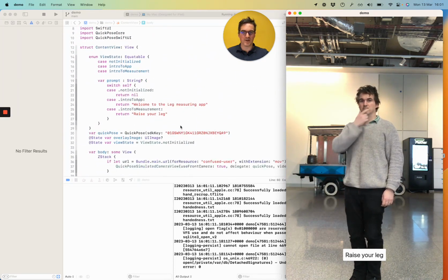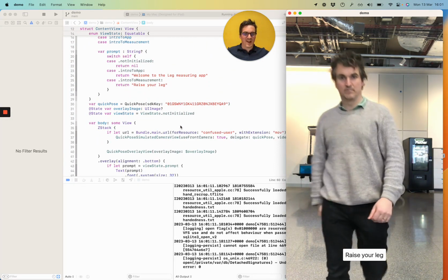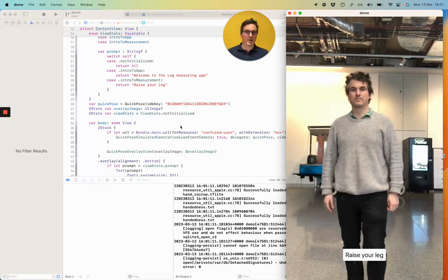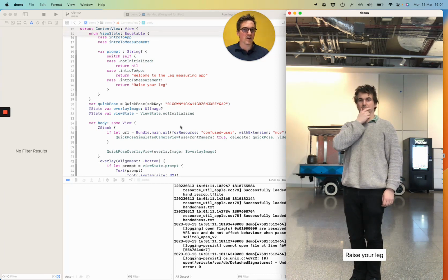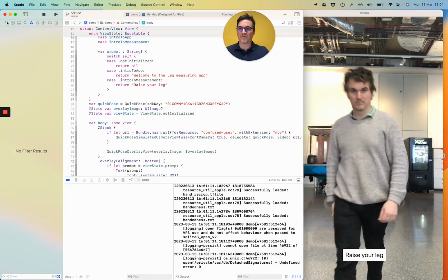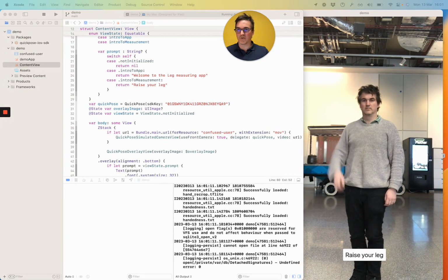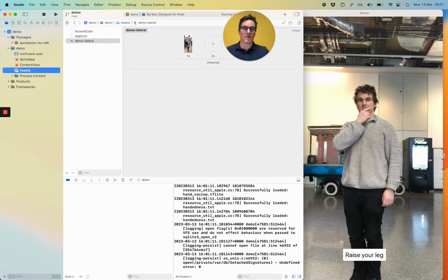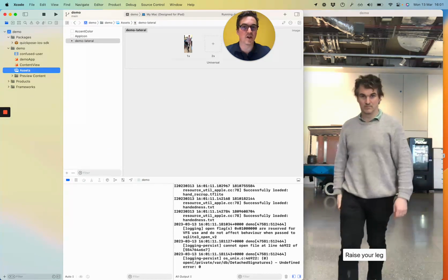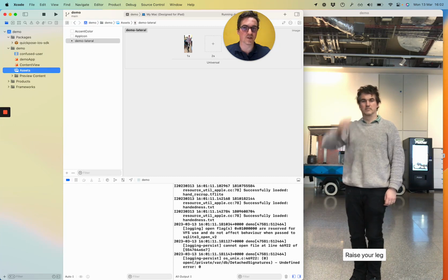Now, what I've experienced from making a few of these AR fitness apps is verbal instructions are always terrible. So I strongly recommend making it visual as soon as you can. I appreciate that you might not have immediate access to a designer or a premium finished photograph, but just sticking a photo of yourself in for now is more than sufficient. So I've got a picture of me doing the lateral flexion, and I've taken this from a video which I'll show you in a few minutes. So it's probably just easier for you to shoot a video doing a few poses and then pick the still out.